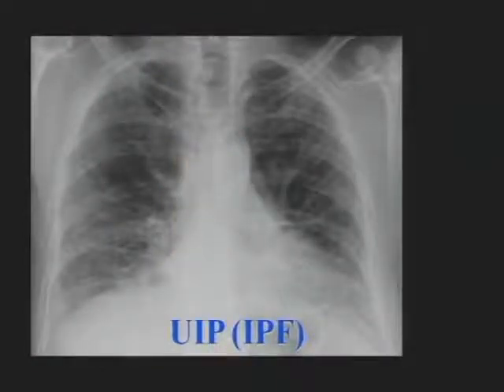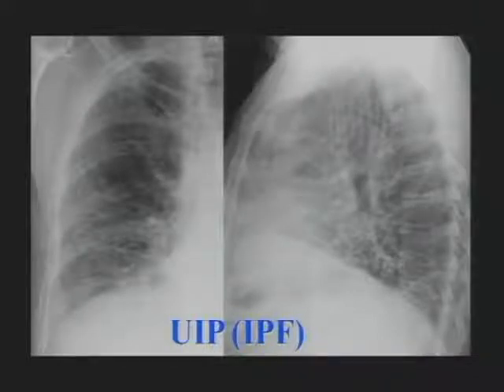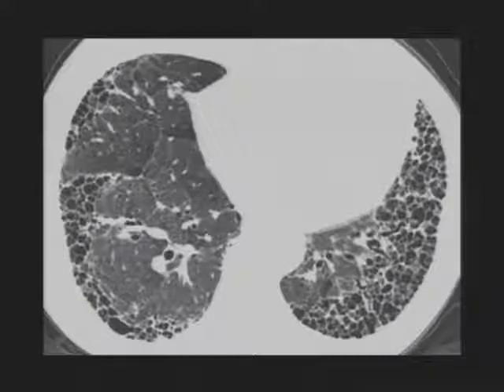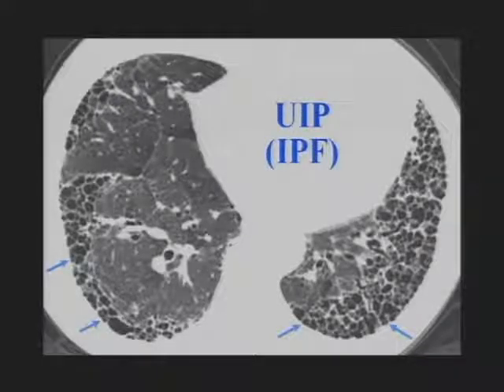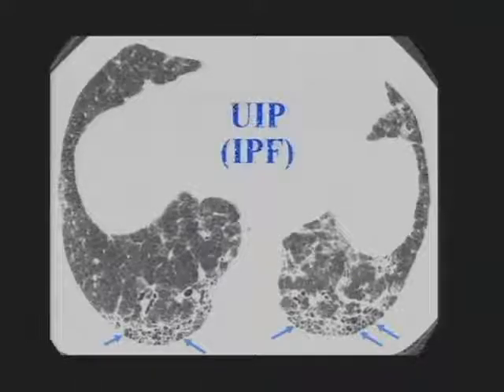This is the plain film appearance of UIP-IPF: decreased lung volumes, small-looking lungs, and increased reticular opacities at the lung bases. The lateral view shows reticulation predominating at the bases and posterior costophrenic angle. Another example of honeycombing on high-res CT shows black holes less than a centimeter in diameter, occurring in clusters and layers with thick recognizable walls — a definitive example in a patient with UIP-IPF. Another example shows posterior lower lobe predominance of reticulation, traction bronchiectasis, and a little honeycombing — again UIP-IPF.